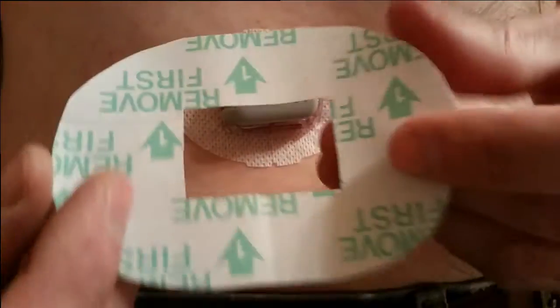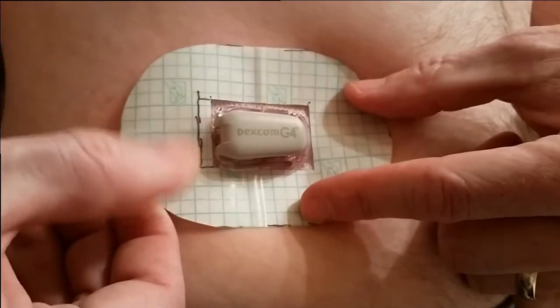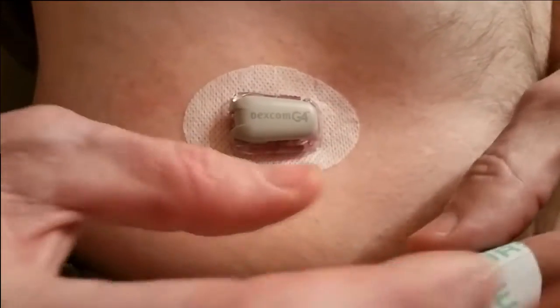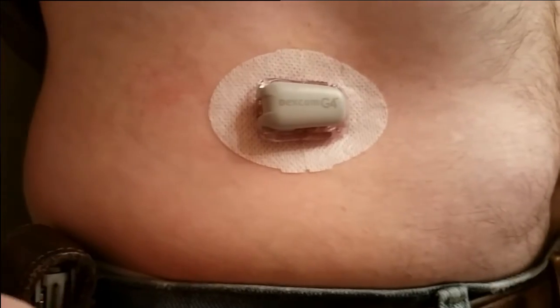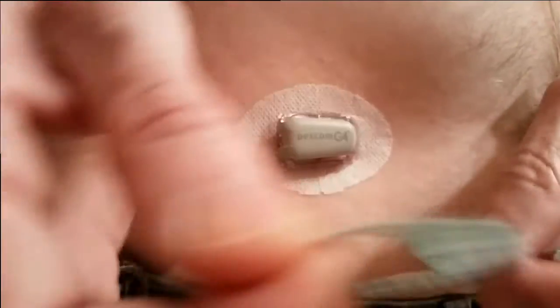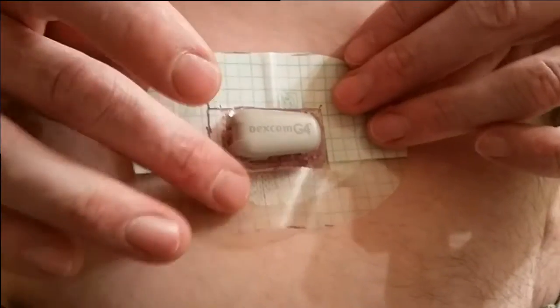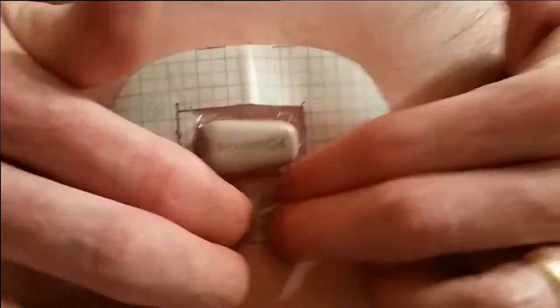Okay. Alright, so now we've made the device, the patch I guess I should say, and you see it fits over the sensor like this. We've got to put it on there, and this is usually a 3-step process. What I like to do is use the smaller side. You'll peel this off, and be careful once you start peeling this off, because this is now very sticky stuff and you only get one shot at this. I put the top part over first as much as I can, get it centered on the sensor, and then touch the bottom part so that it's stuck down. Doesn't take a lot of effort.